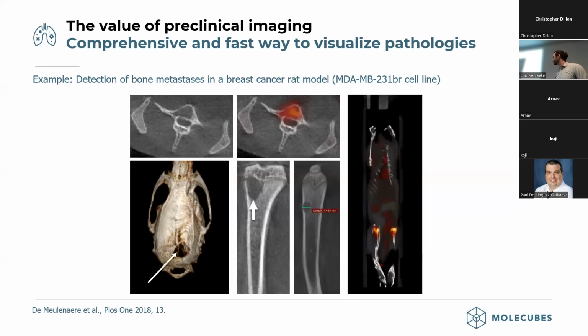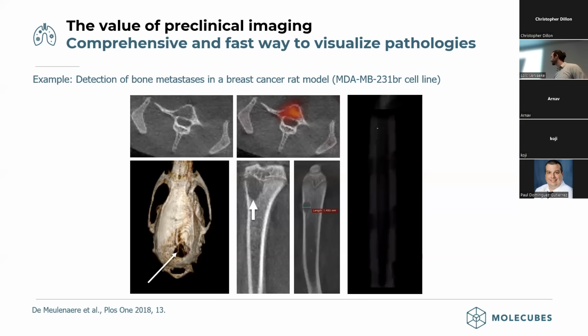And on two levels, you can really quantify this data. Not only on the CT, where you can measure the actual tumor volume, but also the values in these hotspots of the cancerous tissue that you can track over time, after 5 days, after 10 days, after X amount of months. How have these values changed over time?